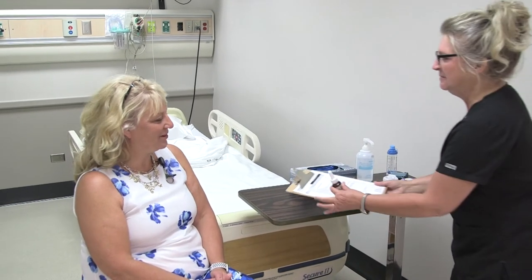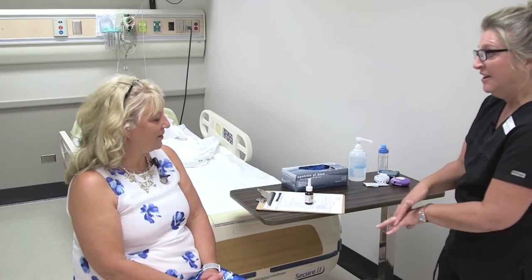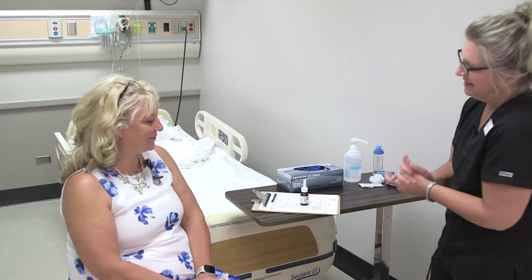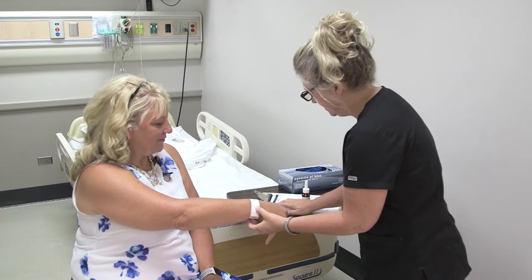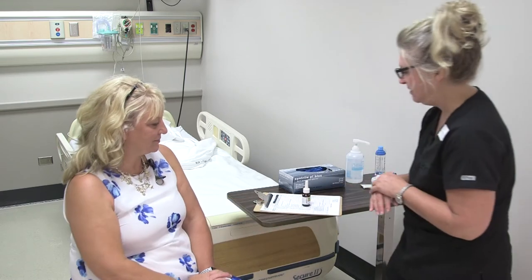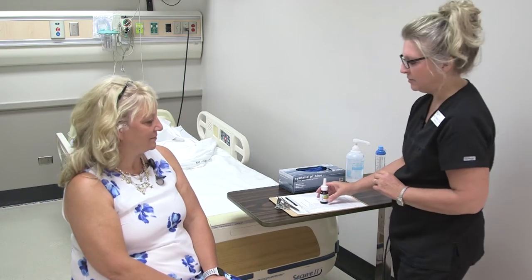Good morning Sylvia, my name is Mary. I'm a nursing student at CVTC and I'm here to administer your nasal inhaler. What would you prefer I call you? Sylvia — perfect. I just want to check your full name and date of birth on your name band: Sylvia Vasquez, 1/30/1966. Excellent. Do you have any allergies I need to be aware of? Good — no allergies are listed on your chart either, so that checks out.